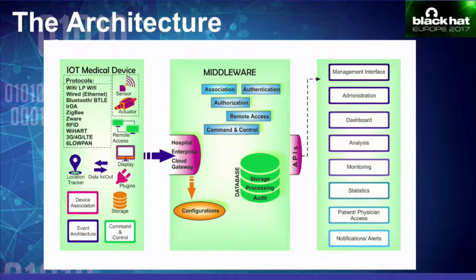It also exposes a few APIs, application programming interfaces, which can then feed into a web portal where, for example, your physician could log in and gain access to patient data. Researchers could log in for further analysis. Even device manufacturers could log in to gather data about the devices and how they're functioning.